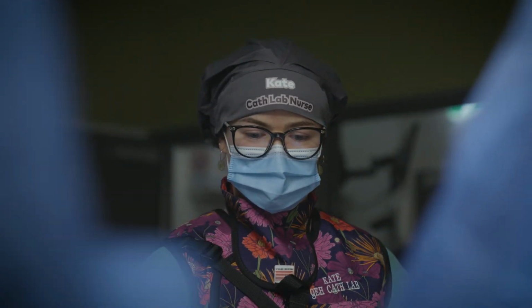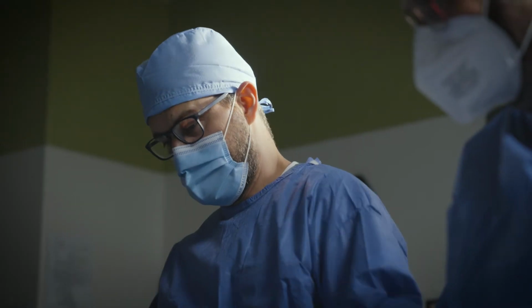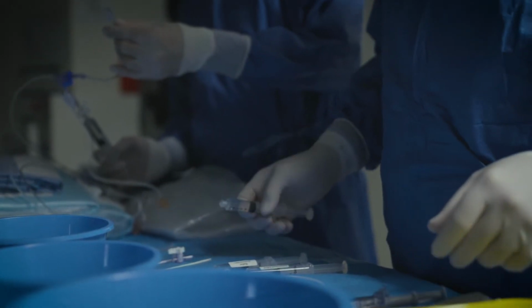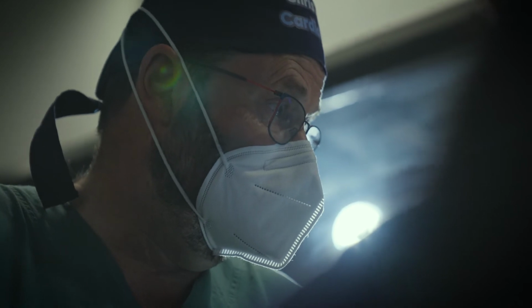In normal people, those abnormalities do not occur, but in people who have chest pain syndromes caused by these abnormalities, we can demonstrate that with the patient on the table. They get their typical pain, changes in their cardiograph, and we can see their coronary arteries virtually disappear due to spasm.